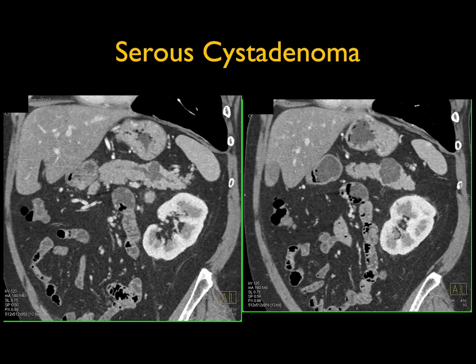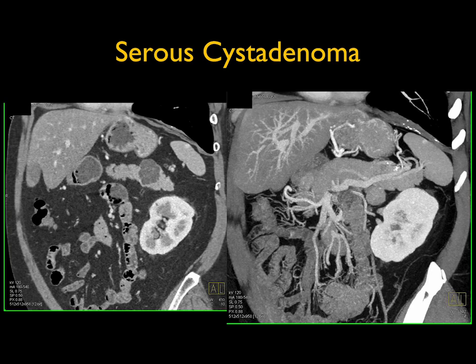A challenge in this area is serous cystadenomas, which can have septations and central calcifications, but can also be purely cystic with no septations — making diagnosis difficult. Serous cystadenomas are benign lesions, sometimes symptomatic because of size. This was an incidental finding; if you knew for sure this was a serous cystadenoma it would be a leave-alone lesion.